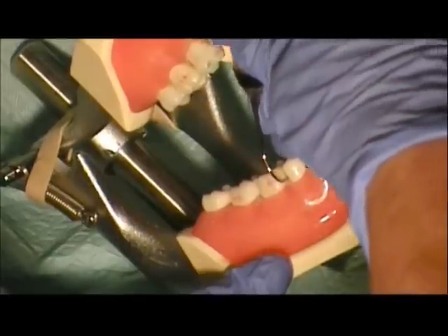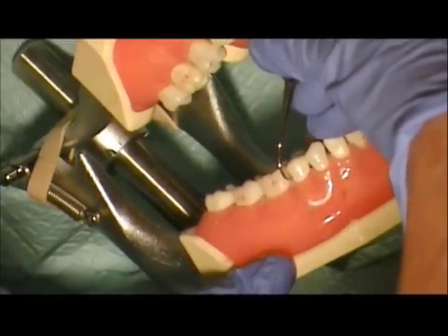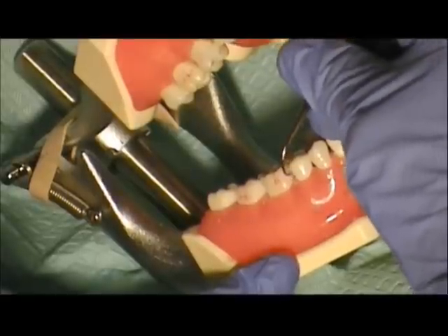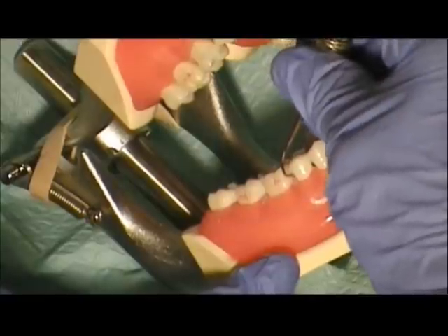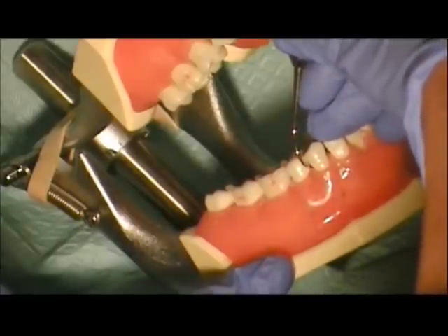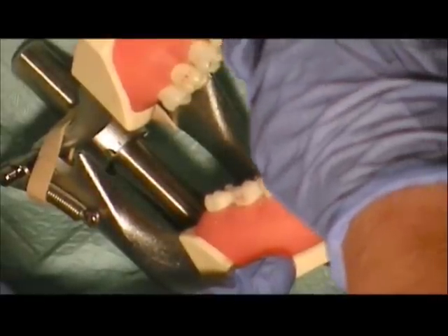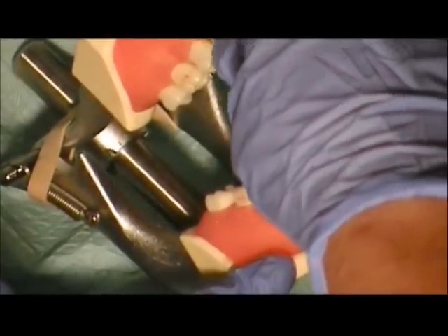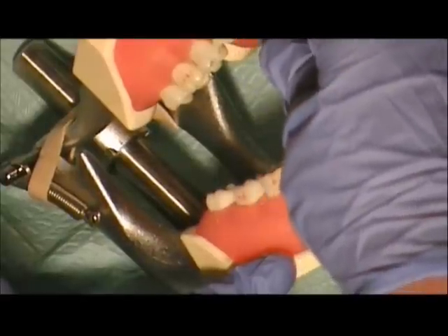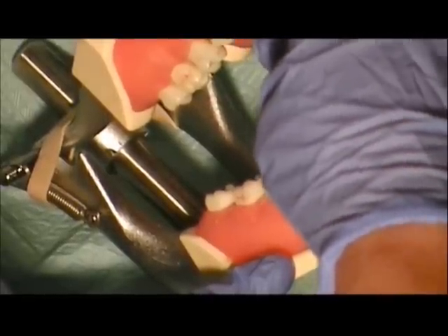Right under the contact. On the premolar, that's our 90 degrees — eyeball to 90, drop it to 70, and use the tip-third to remove the calculus under the contacts. On the mesial, eyeball your 90-degree angulation, tip your face to 70, and lean into the tooth. Remember to angulate that toe-third under the contact to really adapt and activate where that calculus is.